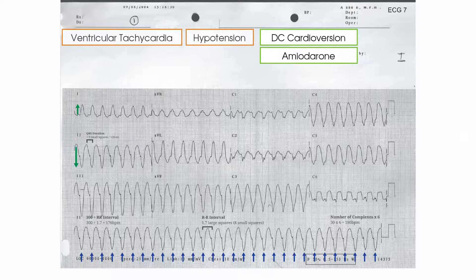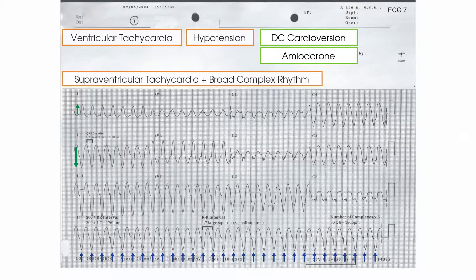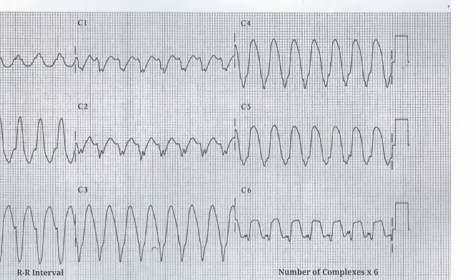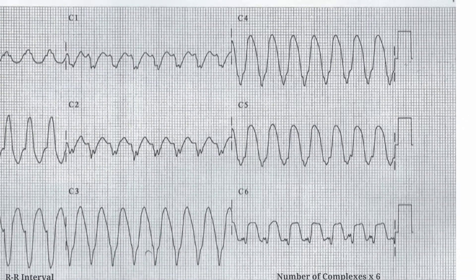Differentiating the broad complex tachycardia caused by ventricular tachycardia from that caused by supraventricular tachycardia with a broad complex rhythm is difficult. There are multiple findings which are predictive of this but none of them are absolute. One finding which is very predictive of this being ventricular tachycardia is the fact that the QRS complexes are downwards pointing across all of the chest leads. This finding is known as concordance.